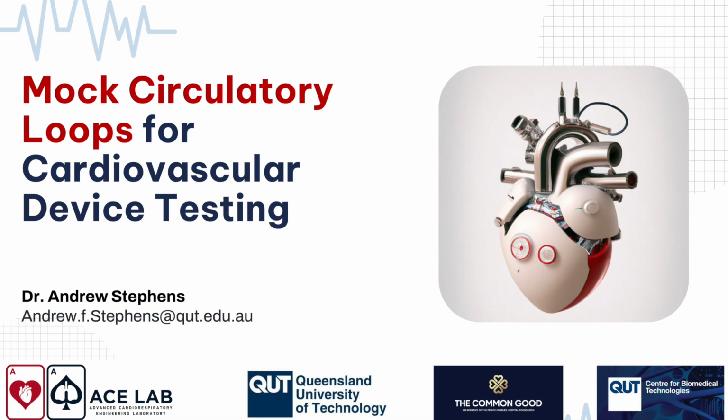It's frequently a good idea to keep everything as close together as you're building it to minimize the effect of inertial differences. And this will become really apparent when you're measuring pressures really far away, where you're getting too much pressure drop for what you would expect inside the healthy human.